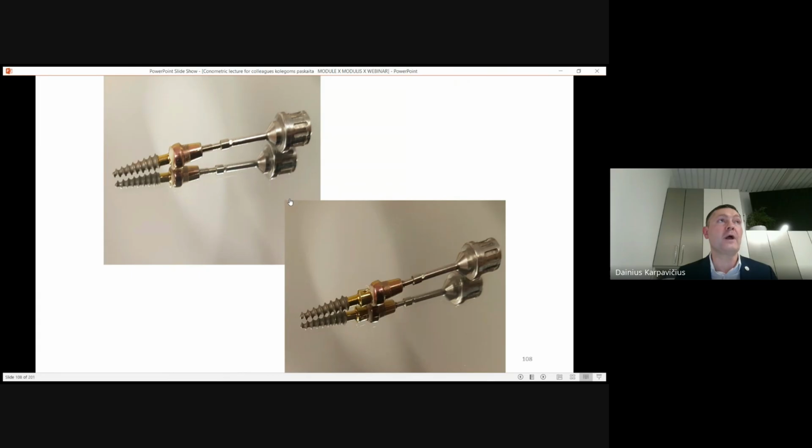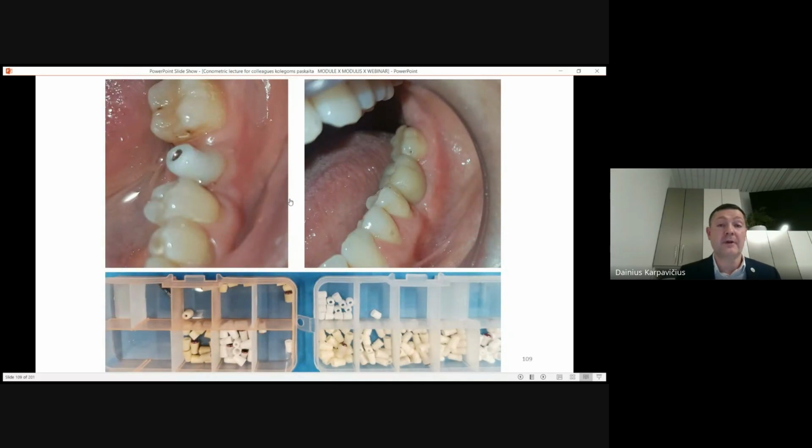So we teach this method as well, if in case sometimes or somewhere in the front, because the front is not for conometric. Might be if it is some bridges or something, but sometimes a doctor asks me, and so we took a look additionally at such a solution, if a doctor put a single implant, maybe didn't properly prepare soft tissues, maybe it's in the front, then he has this additional possibility, and with the retrievability, as I said previously. This is a smaller area.